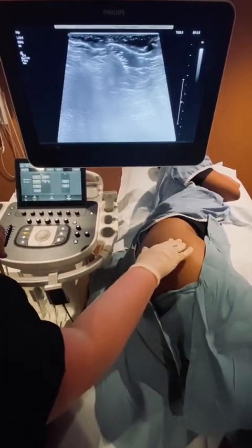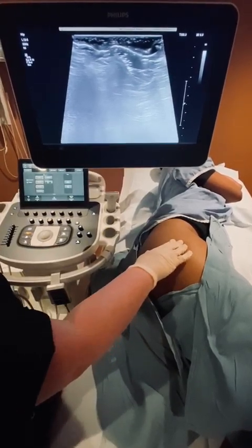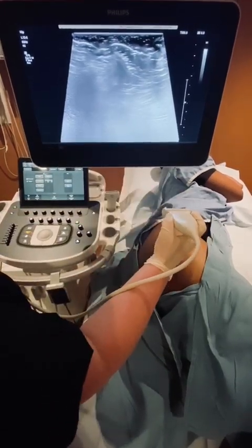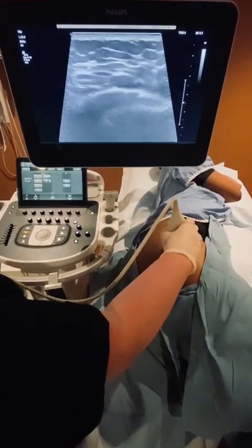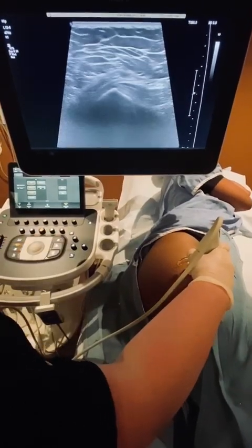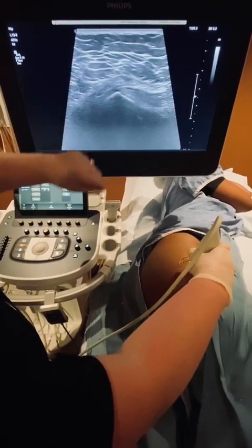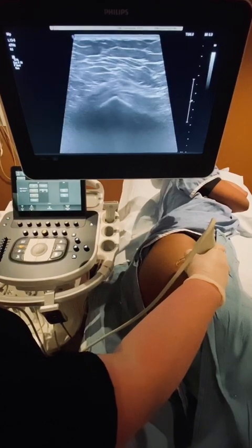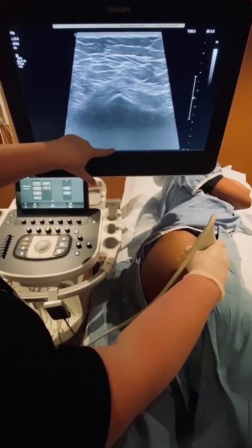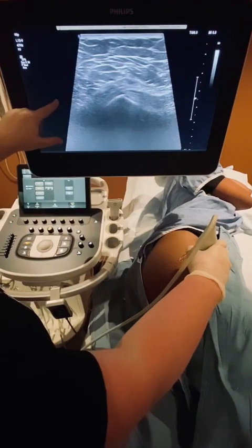To start off, you want to find your landmark, which is the greater trochanter of the femur. You want to start with your transducer transverse on the patient's body with the notch facing towards your thumb. When you put the transducer down over the greater trochanter, the landmark you're looking for right here in the center of the screen is called the apex. Because the patient's on their side, the top of the screen is lateral, the bottom of the screen is medial, the right side of the screen is anterior, and the left side is posterior.